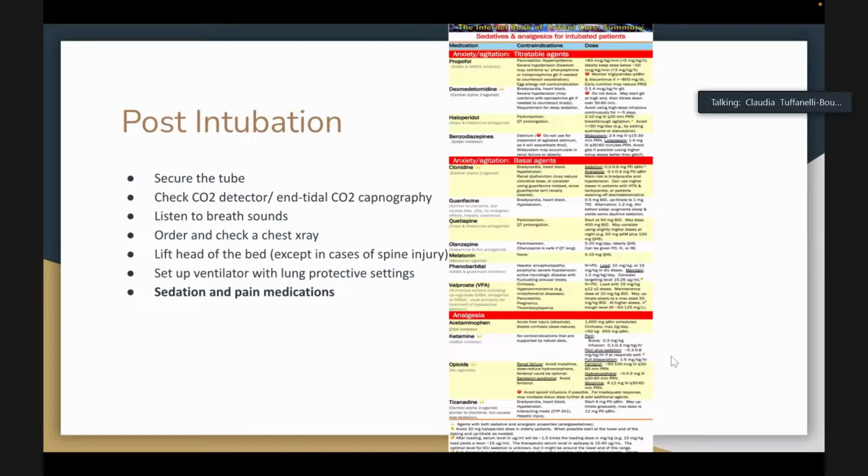You usually want to wait 4, some people say as many as 8 breaths, but at least a few bagging breaths, before you say for sure that it's good, or wait a little time with the end tidal. Because if you're bagging the patient, then you're putting oxygen into the front of the mouth. So those first couple breaths, you could get a false detection of CO2 even if you are in the esophagus, that was just sitting there from when you were bagging the patient. So make sure you wait a few breaths before you really say it's there.